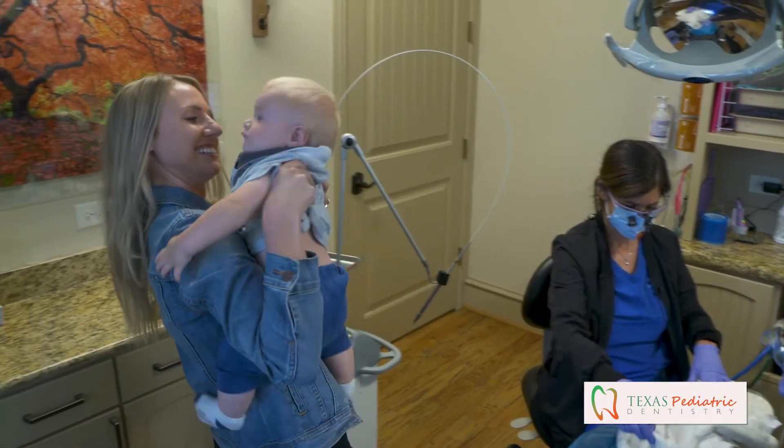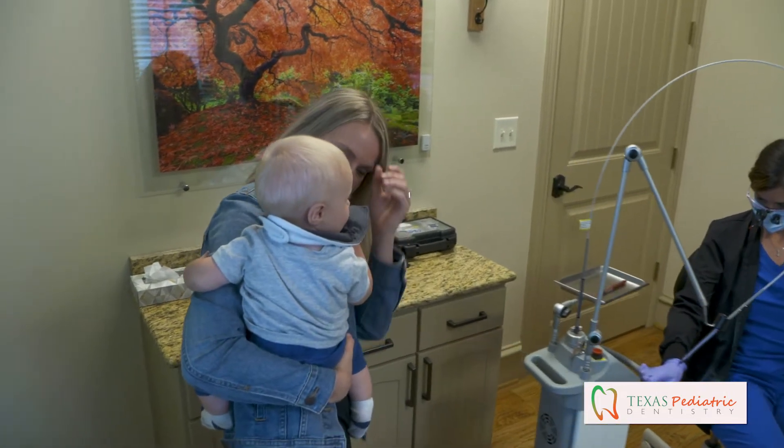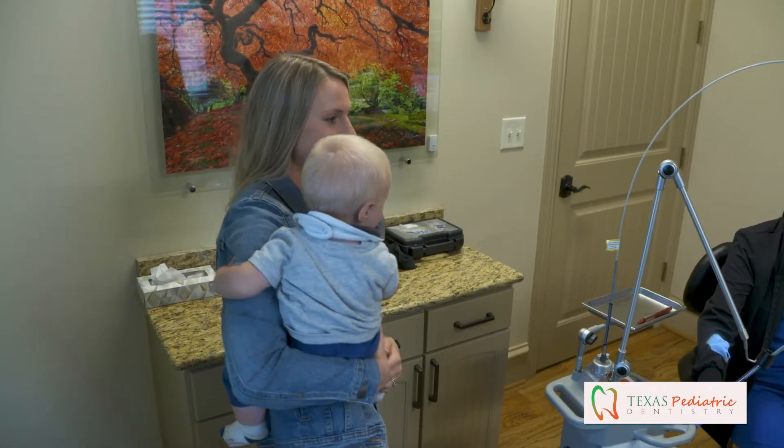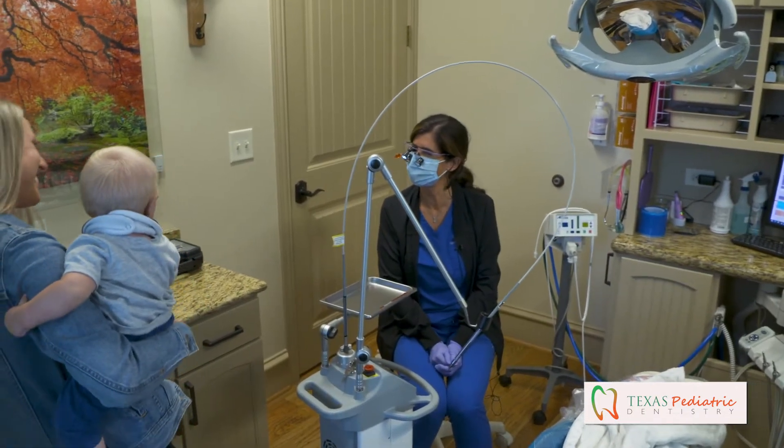We use a topical anesthetic when they're a little bit older. Brand new newborns we don't usually do anything — we just do it so quickly and they're back to mama, not even crying. For older babies and toddlers, it depends on their weight — sometimes topical, sometimes a local anesthetic — but that's enough to get them through it. Because it's so fast, I wouldn't say painless, but very low pain — kind of feels like a rubber band snap. So there's no need to put them to sleep.